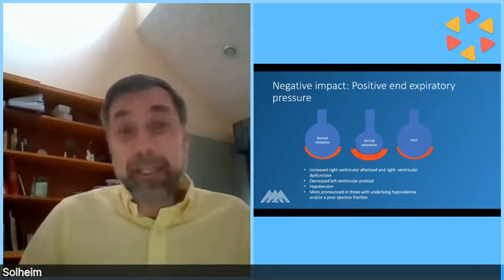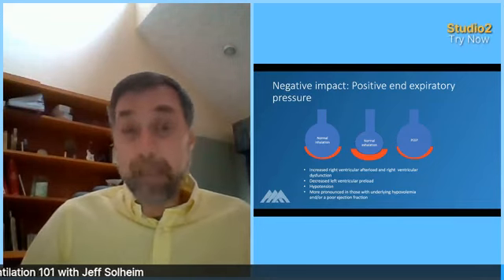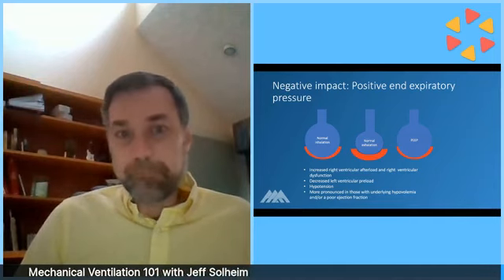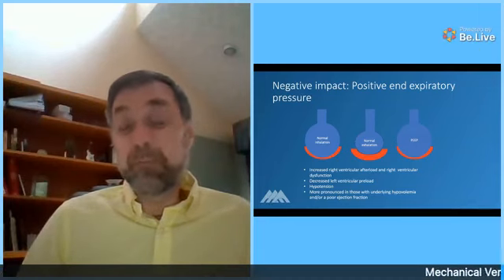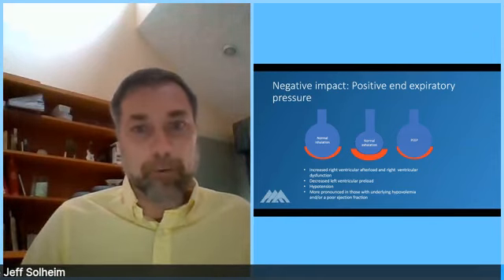Okay. Now, sadly, as your patient's lungs become more fibrotic, especially with the COVID virus, tidal volume and respiratory rate become less and less of an option. And you may find that even at a normal respiratory rate of 12 and a tidal volume of 5 mLs per kg, they may still have elevating CO2s. And at that point, if the lungs are really stiff and non-responsive, you may end up not being able to do much. You may have to allow the CO2 levels to climb, and that's what we call permissive hypercarbia. It's not ideal, but it's the reality of stiff lungs, and it's part of going with the COVID virus.